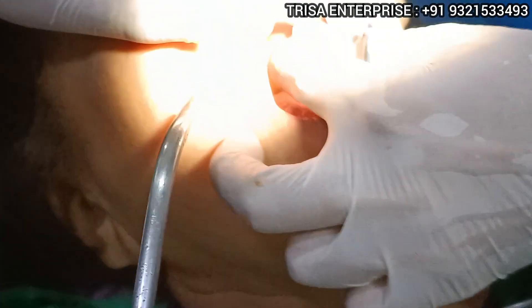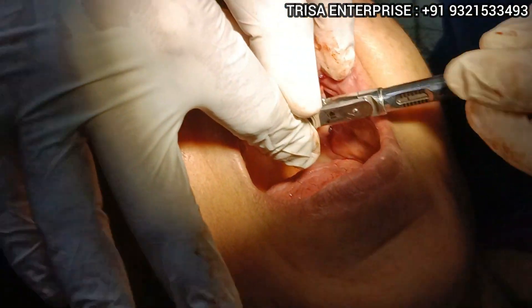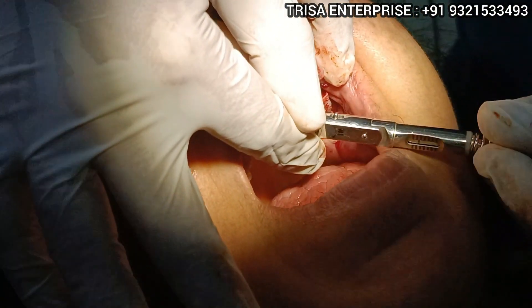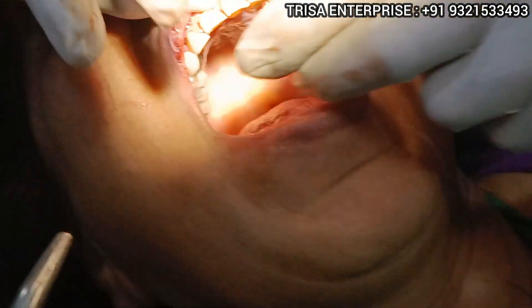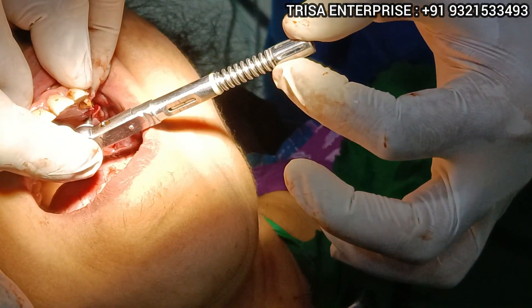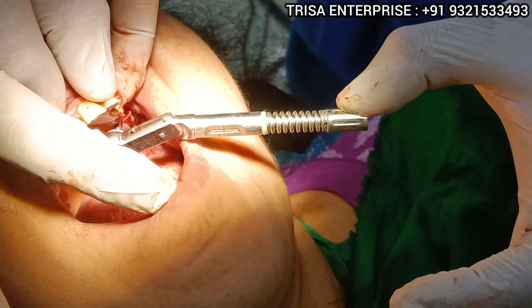You can see the nice placement of the driver right here. I will show you the torque I am getting — almost like an infinity torque. You can check this also with your driver right here; it is almost like an infinity torque.